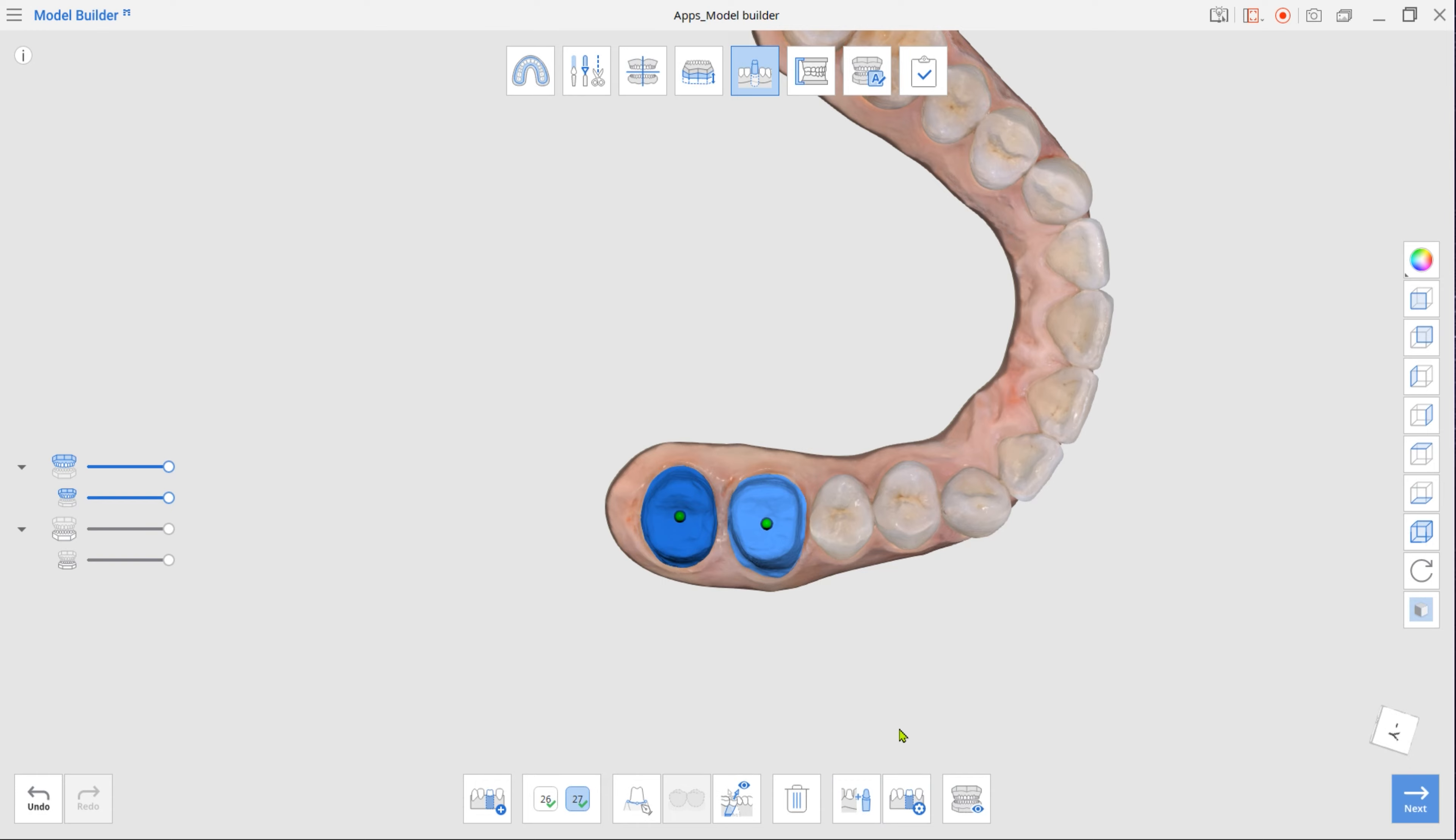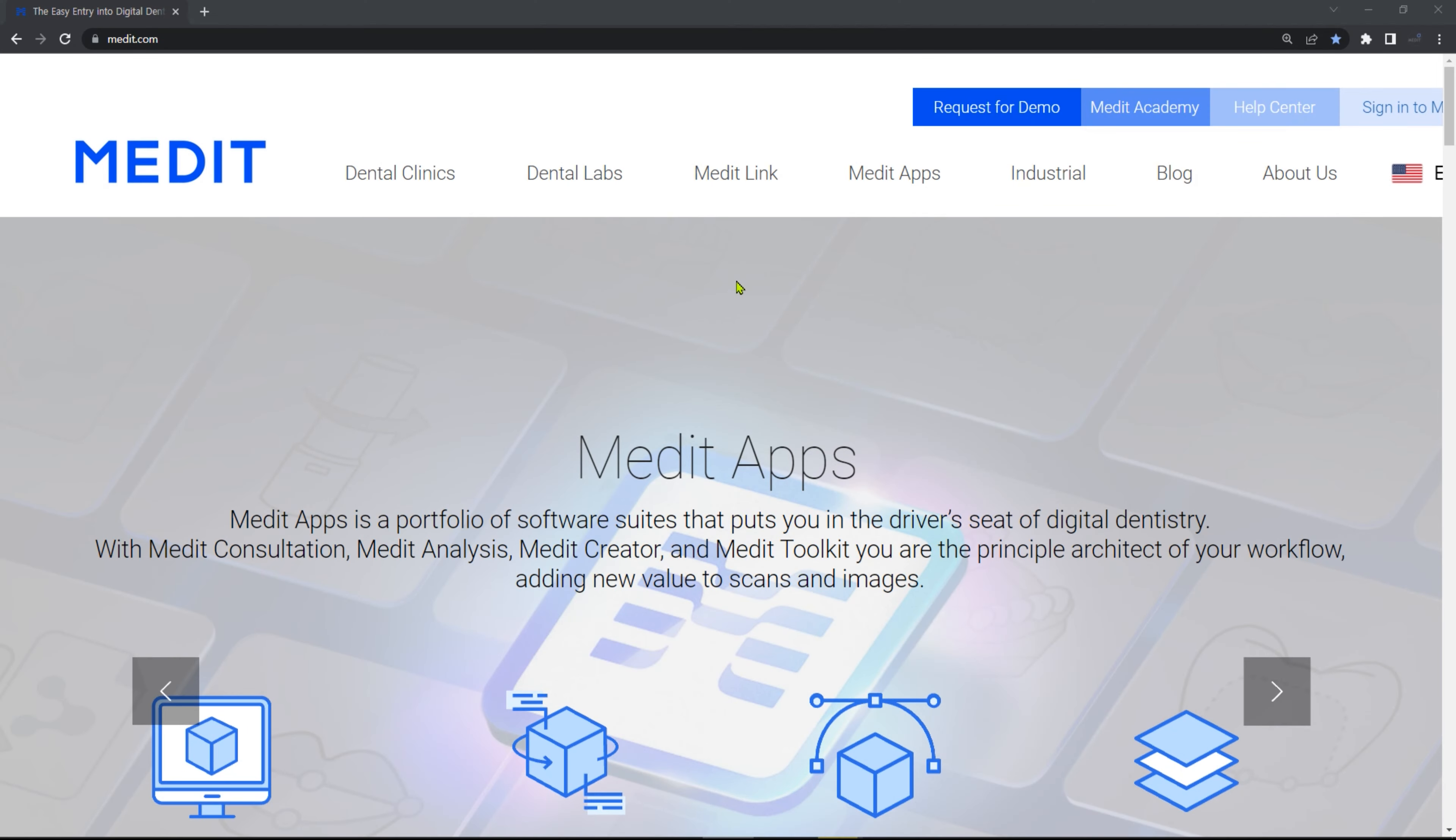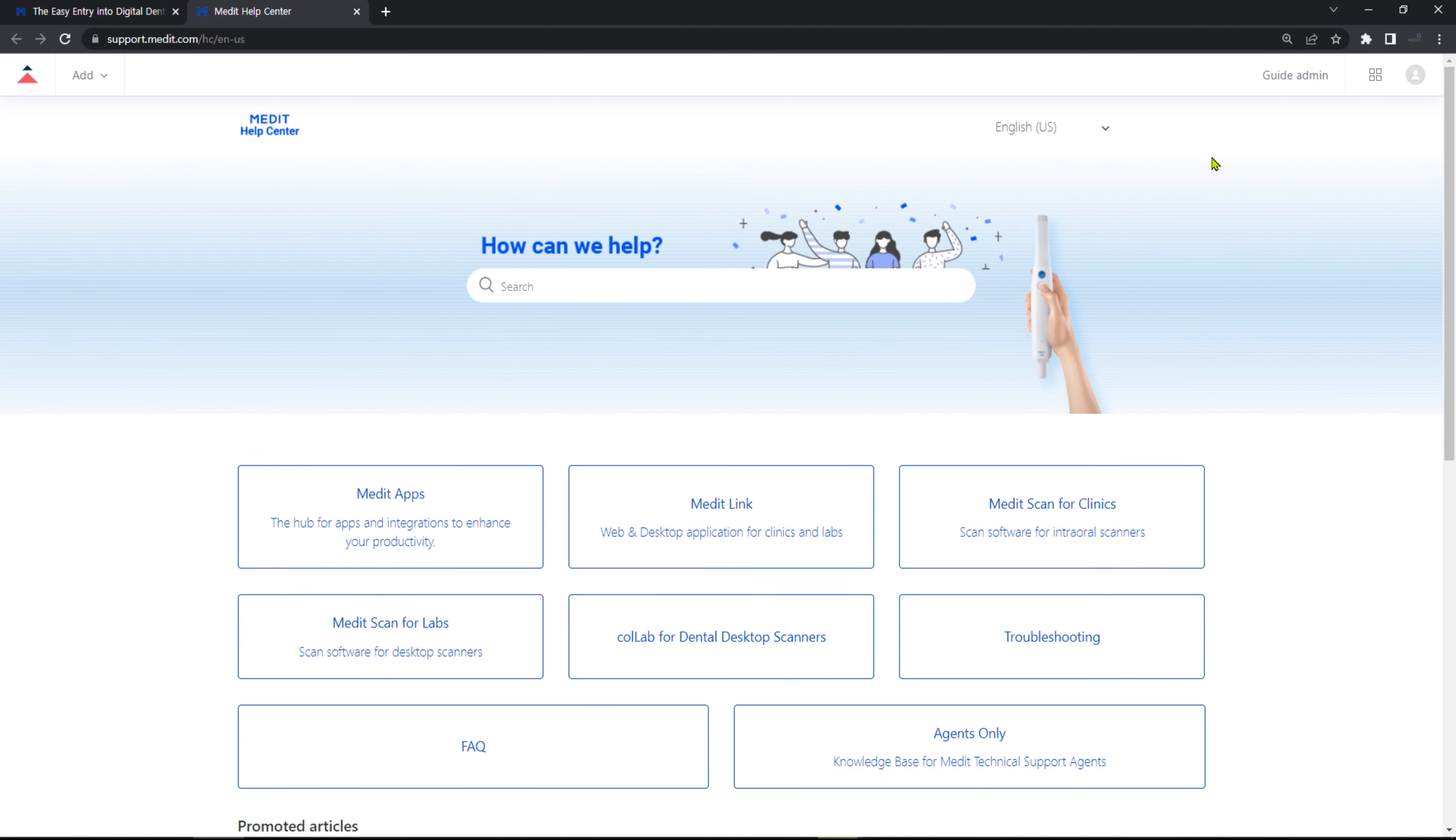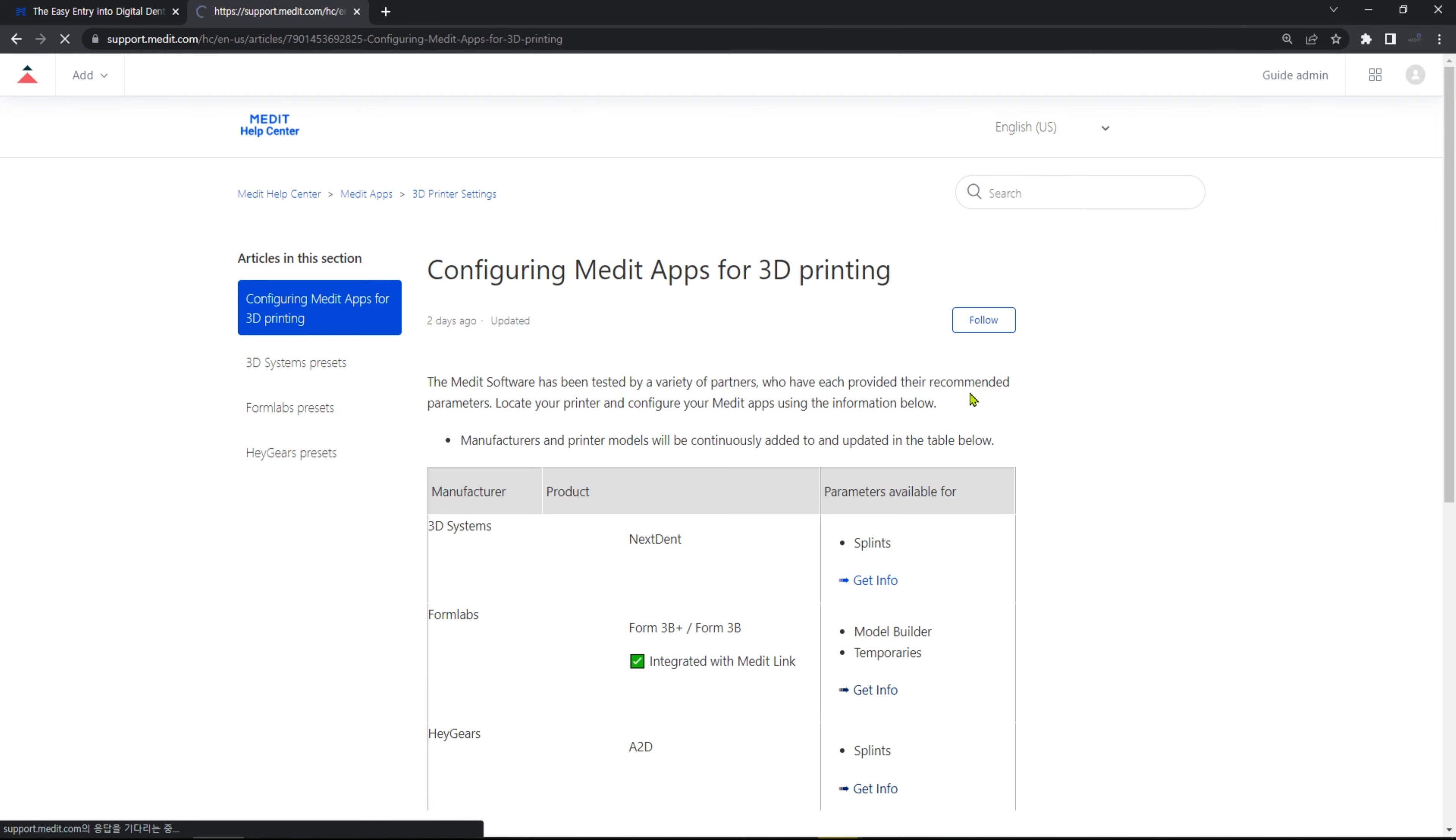Finally, adjust parameters for the die fit using Die option. To have the best result when printing with your specific 3D printer, check out our partners' recommended parameters in Medit Help Center.